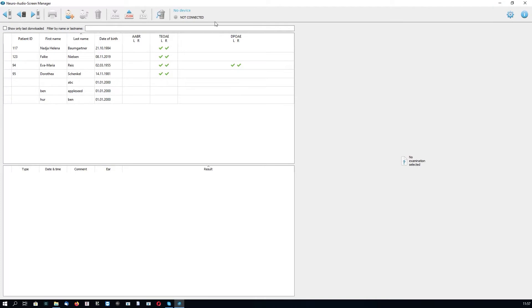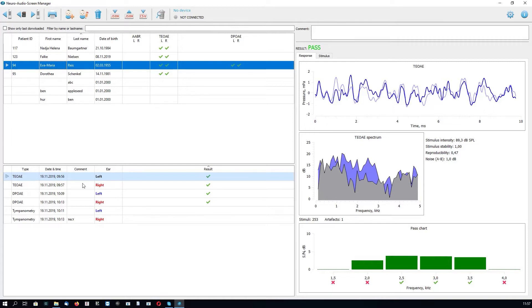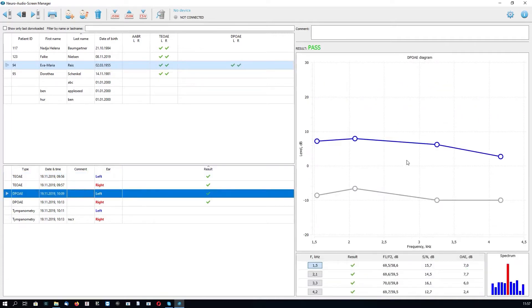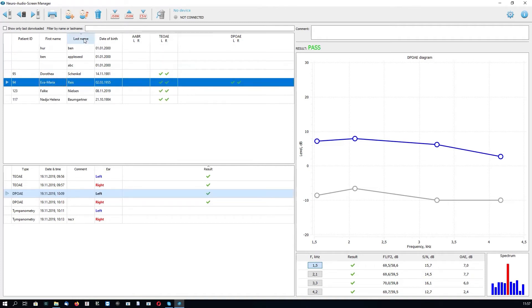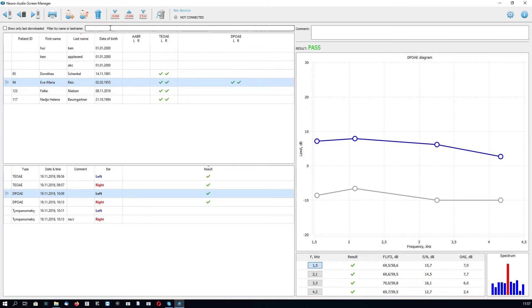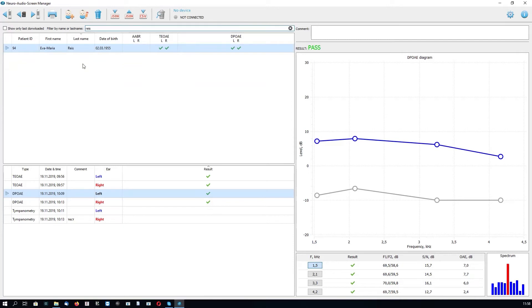The main window will appear on screen. At the top there is a toolbar with buttons. Below it is a table with patients stored in the database. When you click on a selected patient, the table with test results of this patient appears at the bottom left side. When you select a specific test result, detailed analysis graphs and charts appear on the right-hand side. You can sort the table by clicking on a column header, or search for a specific last name by typing it in the search field above.